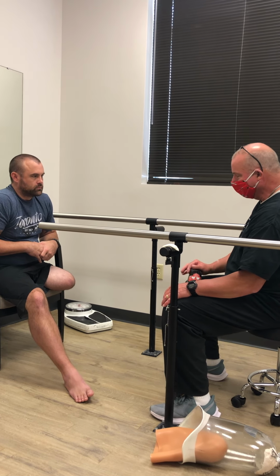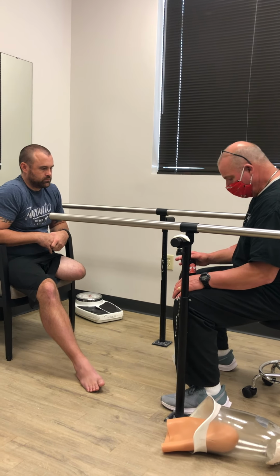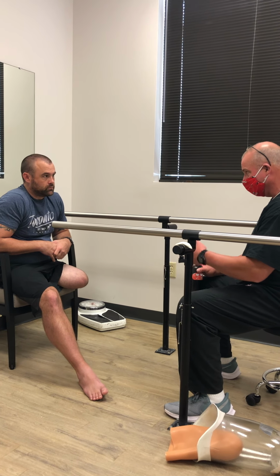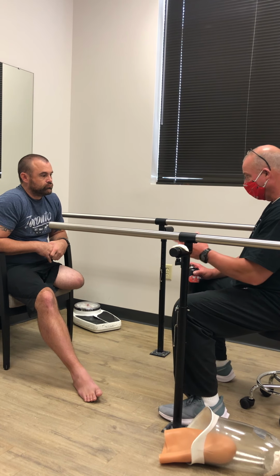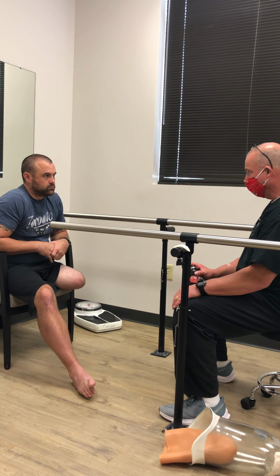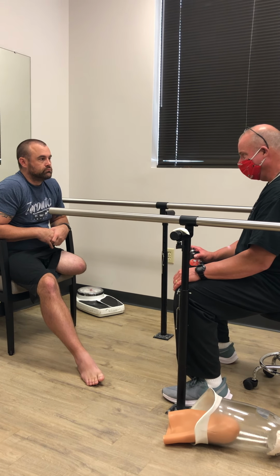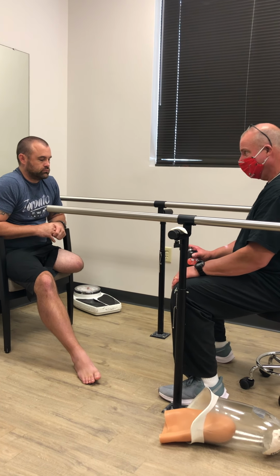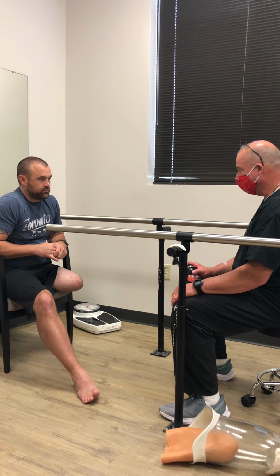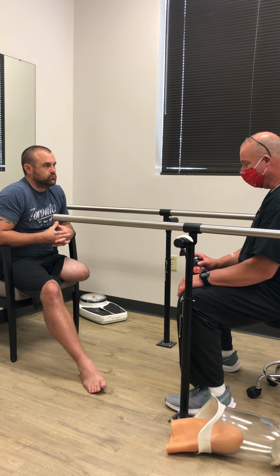So it's just a matter of everything being difficult when you've got to take everything off. But chances are you're going to change your socks when they get dirty, and like anything else, you'll flip it up, pull the shoe off, pull the sock off, and you'll be staring at the base of the foot anyway. So you'll be able to tell really quickly if it's in good shape or not. Gotcha. If it's starting to get torn up, and you're two or three weeks to a month out before a storm, call me and say, hey man, I need a foot shell. We'll call your company, and I'll get you one ordered, and you can swing by and I can pop one on in no time.